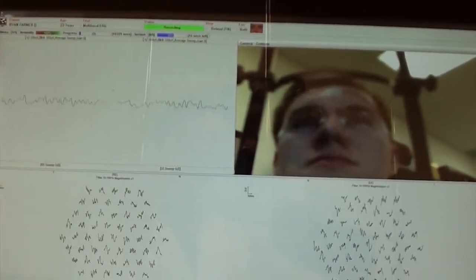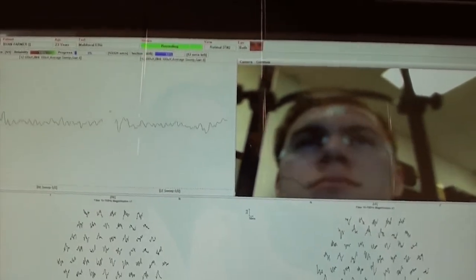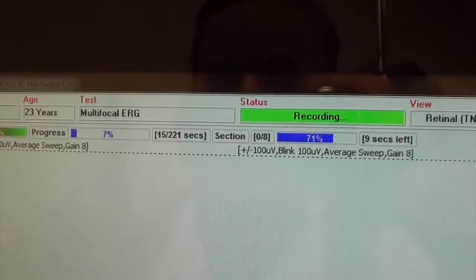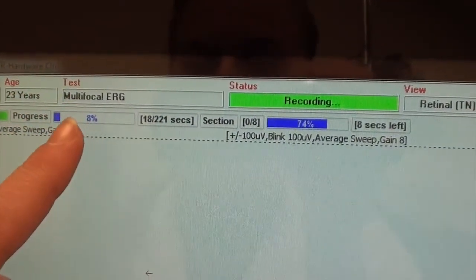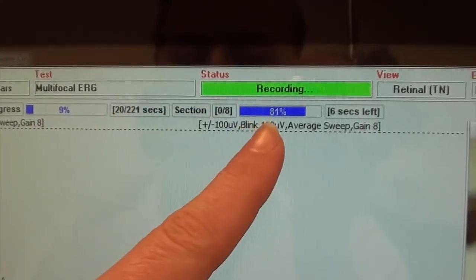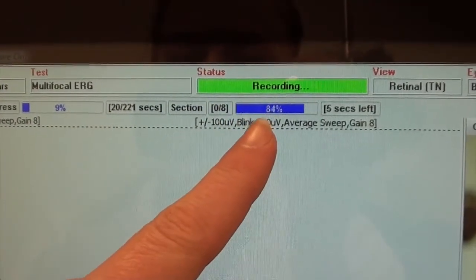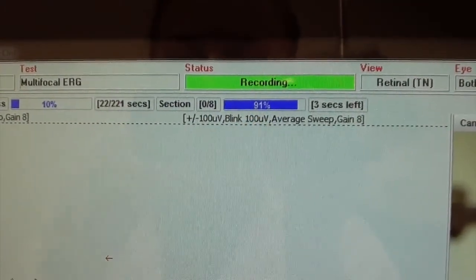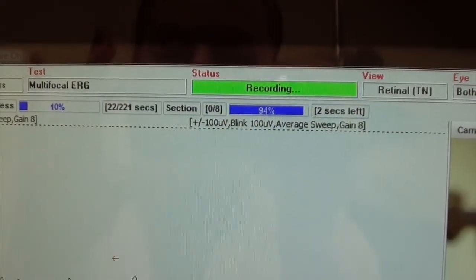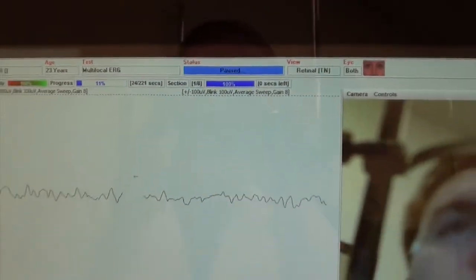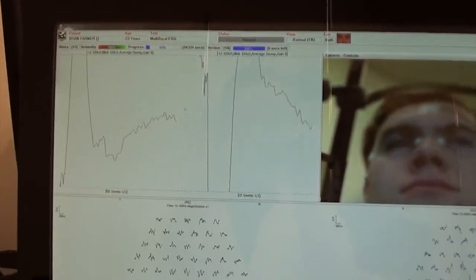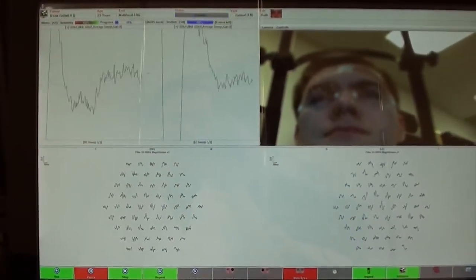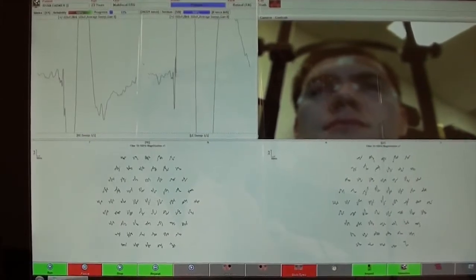When the test is recording, there are two bars to look at: the total progress bar and the per section progress bar. There are usually eight sections to this protocol. And at the end of a section, you will hear a chime.